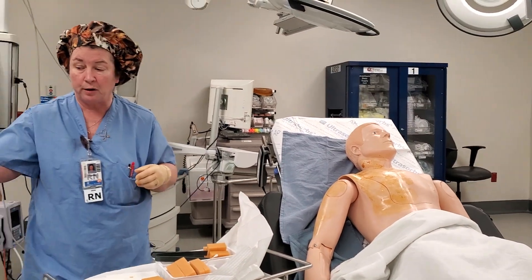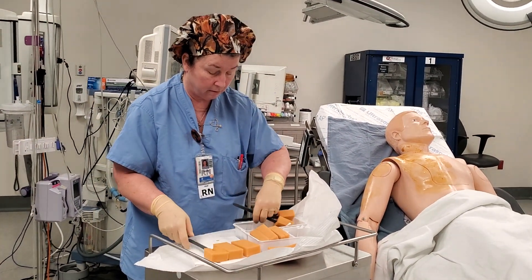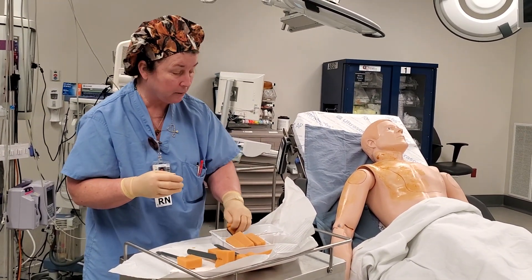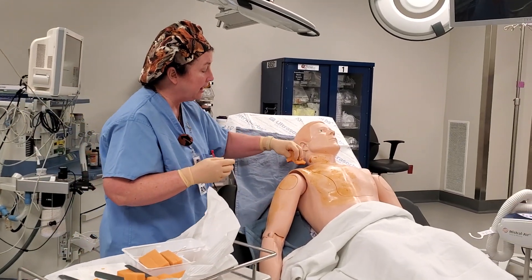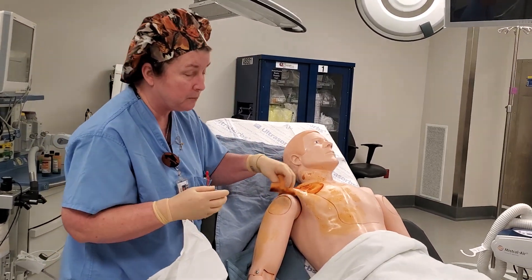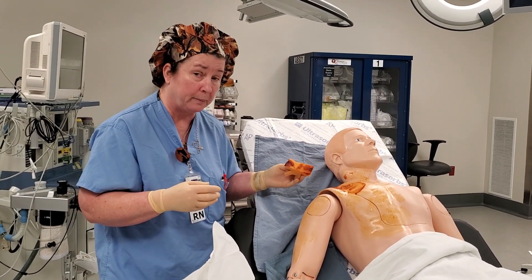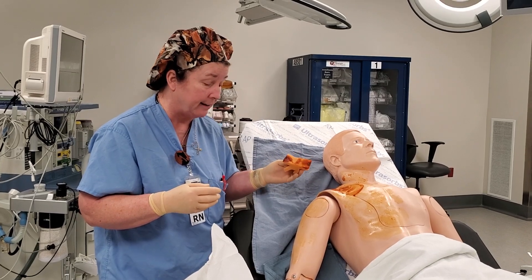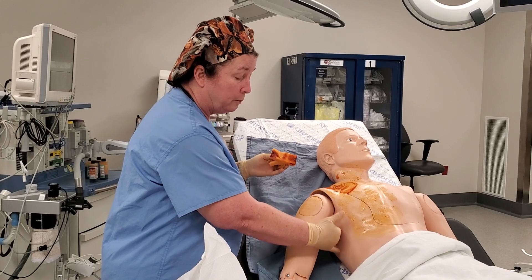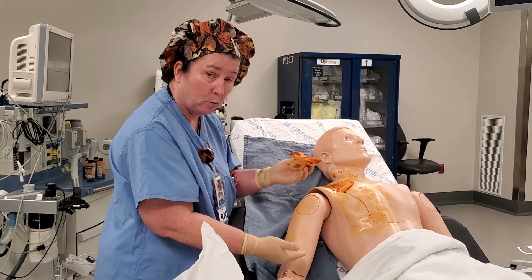When you go to use the paint, we're going to use our circles and expand out. We do not blot the paint. The paint needs to air dry for three minutes if you're using the iodine. The last area to be prepped would be the axilla, making sure that you don't touch the bed with your sponge.